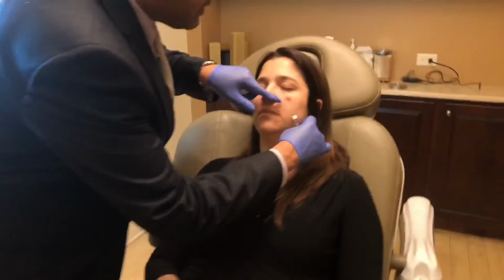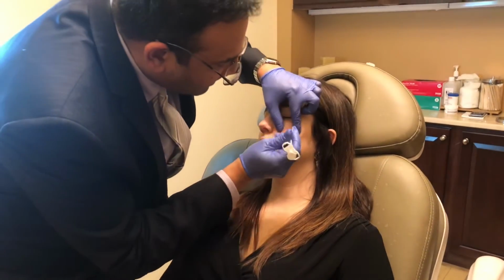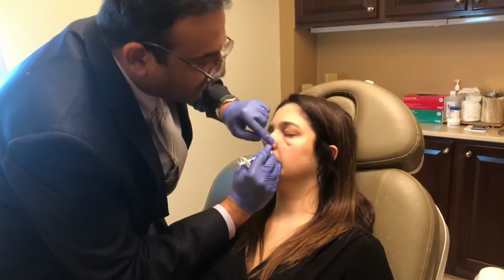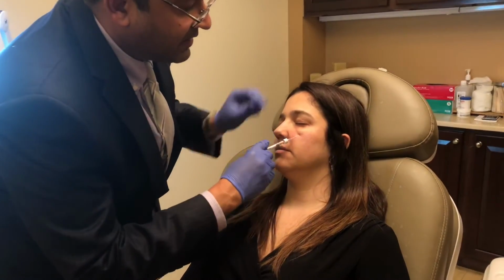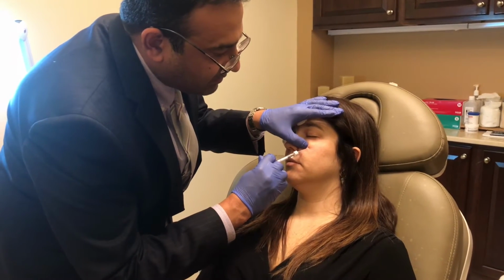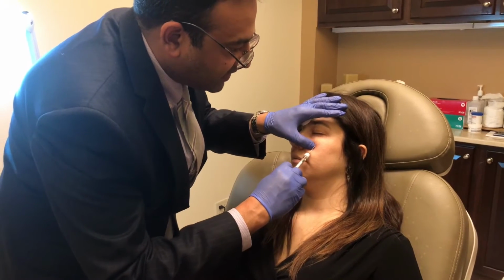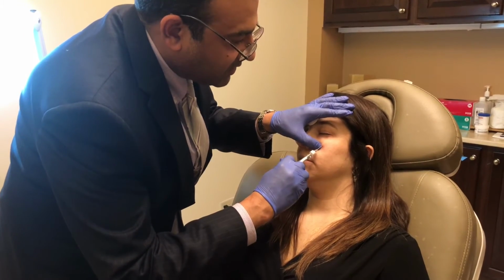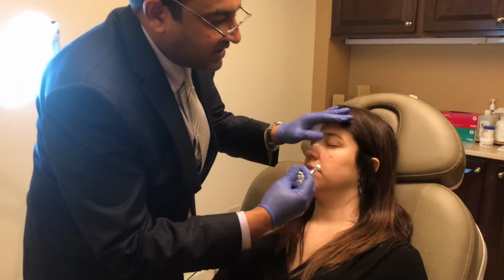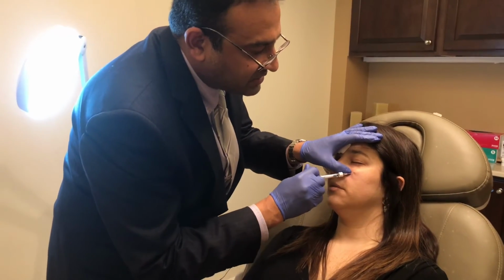I'm just going to come over to the other side. You're going to feel a little tugging on your face. And then we're going to go in again, and now you're going to feel a tiny bit of pressure. 1, 2, 3. Good. And now we're just kind of filling in the side of the tear trough. And that part's done. And now we're going to just give her a little bit of tiny pinch. Just enhance the cheeks just a little bit more.